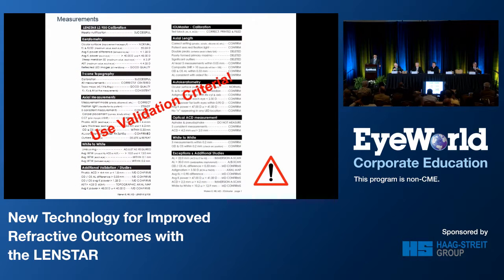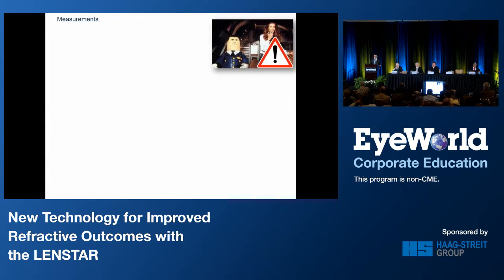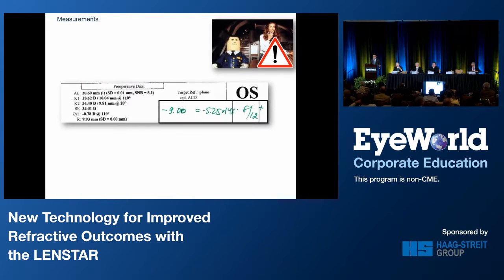It is also important to validate your data, and useful checklists are available on Dr. Hill's website. Now, always be alert and try never to cruise on automatic pilot mode. I want to show you an extreme example of what can happen when one stops paying attention to details. Now, this patient was referred to me several years ago with a huge myopic surprise following an uneventful cataract extraction. Now, on a closer look, one can see that something is strange.